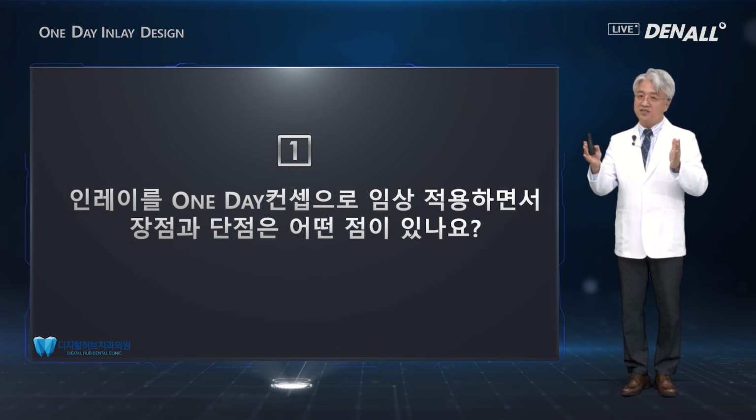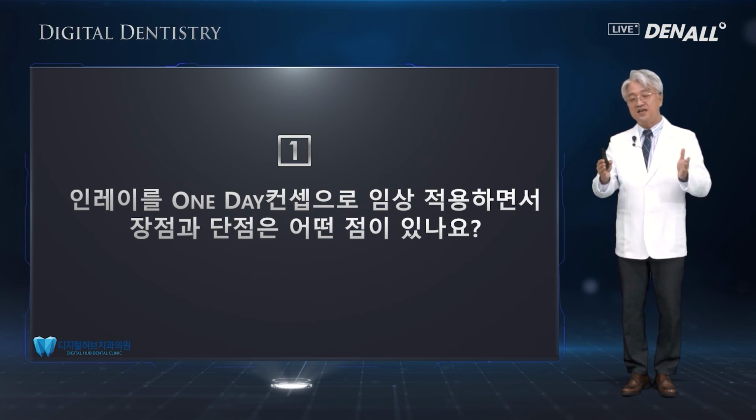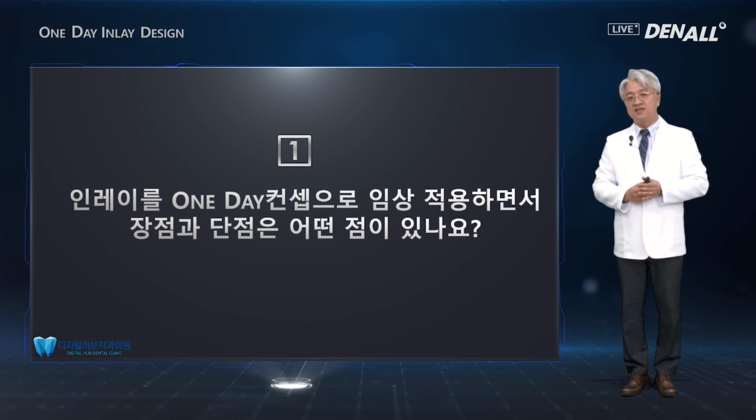But now with the help of CAD-CAM system, time has been cut short and the steps have been simplified. So the inlay production time, the effort it takes to do that, and the time you need to set and deliver to the patient are all saved. So one visit is sufficient, and that is the biggest advantage.